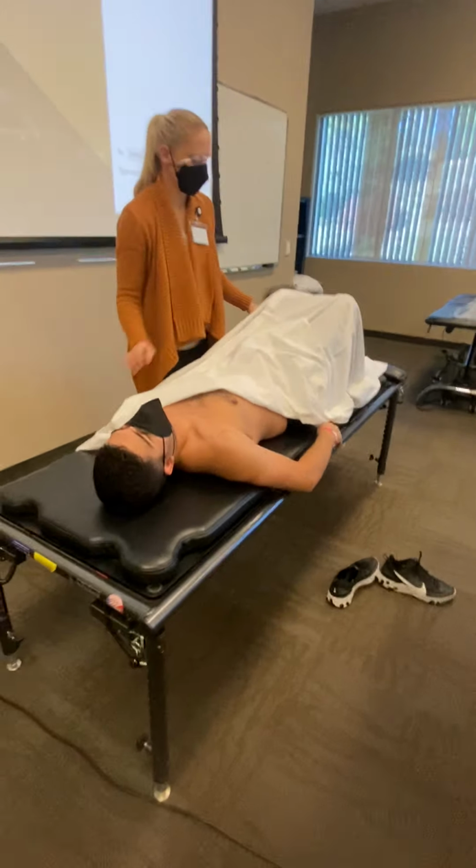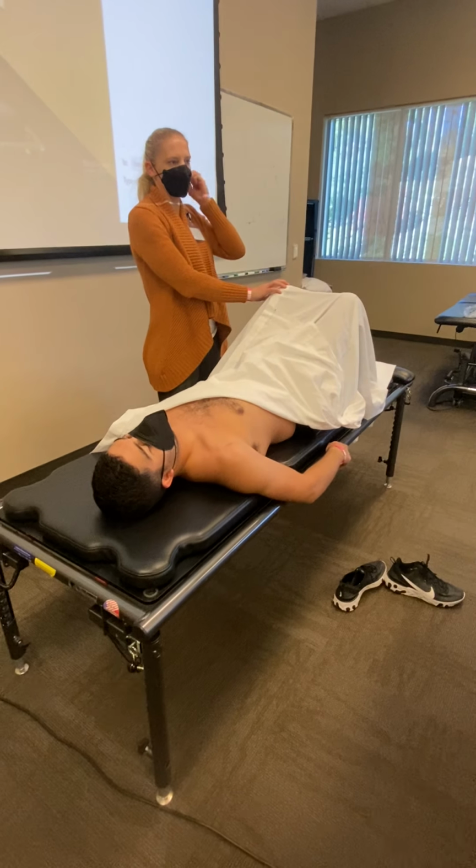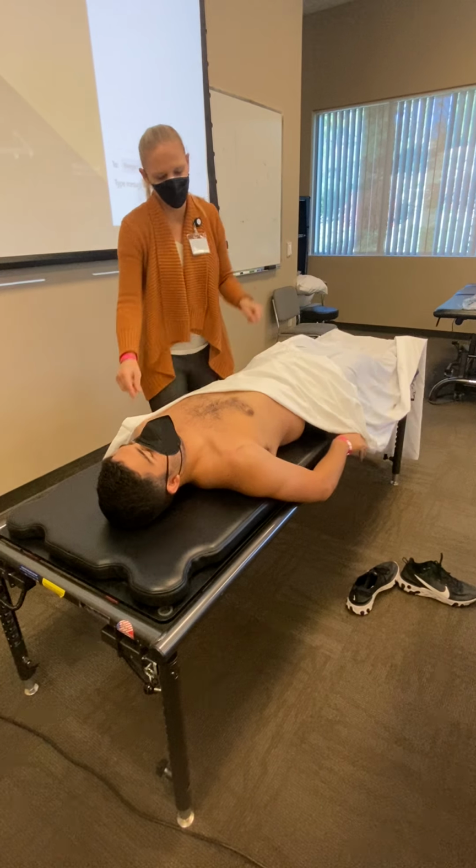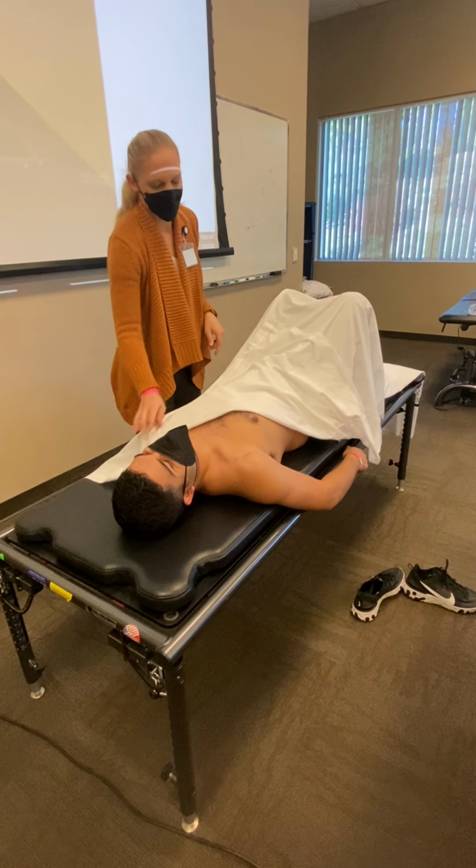So draping, he's cheating for me. He put his knees up in the hook lying position for me, but this is how you would want your patient.